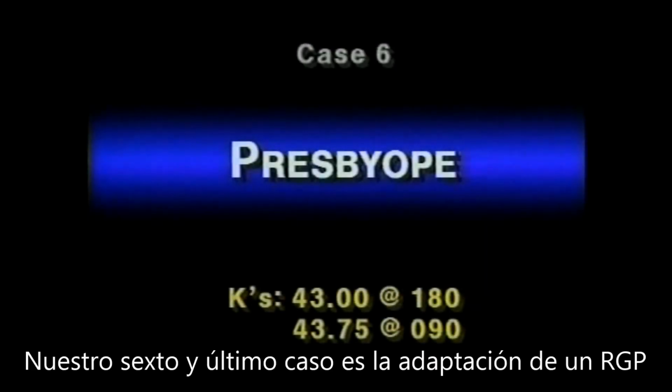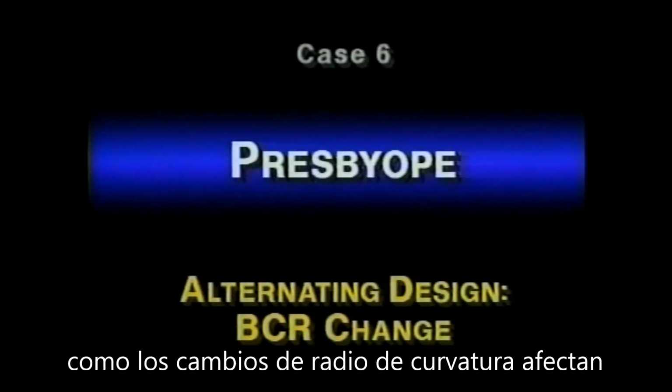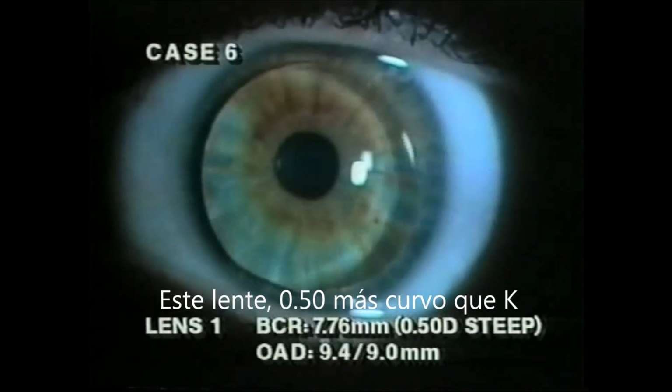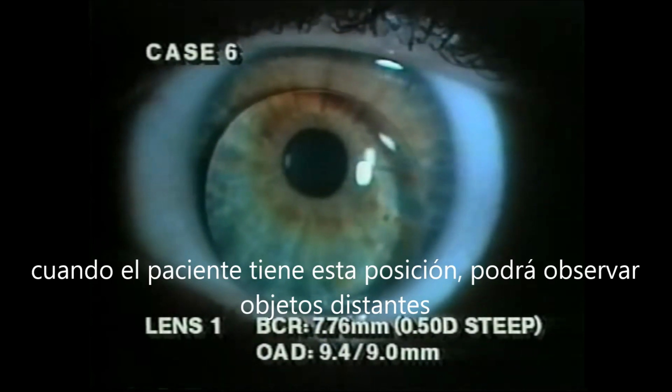Our sixth and final case is the presbyopic rigid lens patient with low with-the-rule astigmatism. The first series of lenses will show the effect of base curve radius changes on the fit of a prism ballasted alternating design bifocal. This lens, fit steeper than K, positions inferiorly after the blink. At first glance, the movement appears desirable, as the distance zone would be positioned in front of the pupil when the patient views at distance.